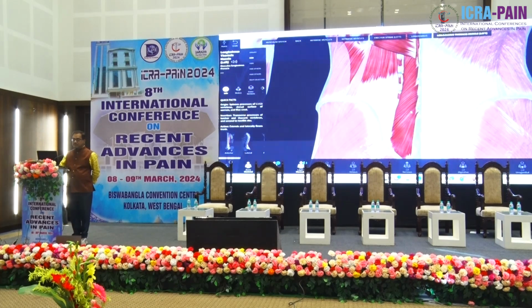Now the multifidus is exposed. So multifidus is most medial, but a little deeper. Longissimus is also medial, but it is superficial. And multifidus lies over the lamina. In between the 2 lamina, the multifidus muscle is there. But longissimus starts from the facet joint complex and lies over the multifidus.